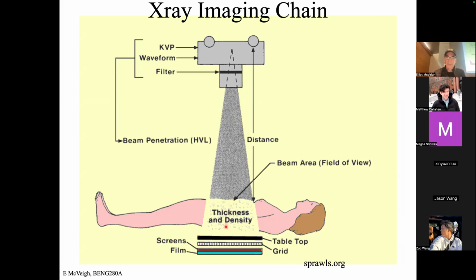We transmit X-rays through the patient, through the table, which is basically X-ray transparent. There's an anti-scatter grid here so that if my X-ray is coming through this way and interacts with the patient and causes a Compton scattered photon to come out this way, I don't want it to hit the detector over here, because that's just random noise.